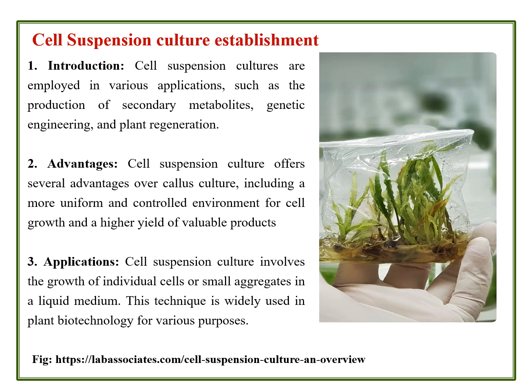So the next one is the cell suspension culture. What is cell suspension culture? These are employed in various applications such as the production of secondary metabolites, genetic engineering, and plant regeneration. So see the picture here. The cultures can be maintained within a liquid devoid of agar.